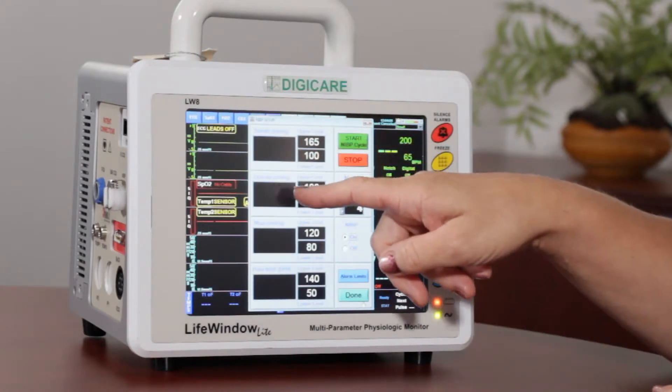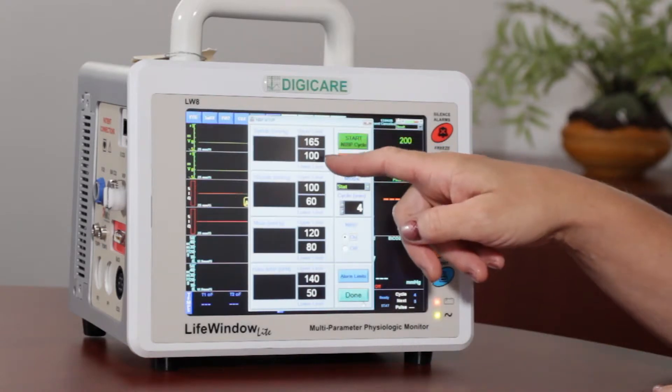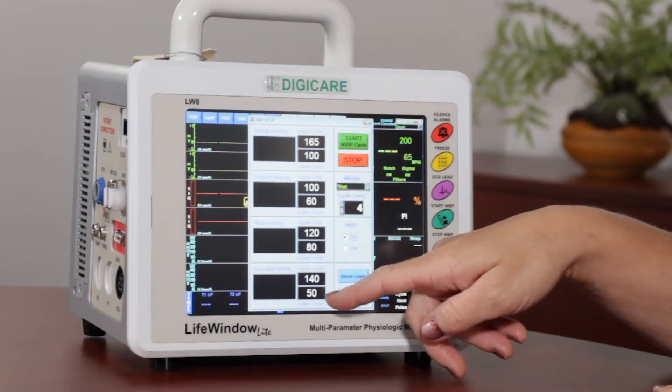The left column has your systolic, your diastolic, your mean, and your pulse. And then to the right of that is your upper and lower limits for all these alarms.